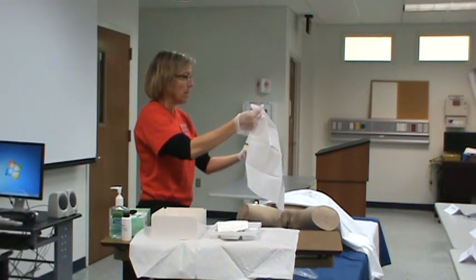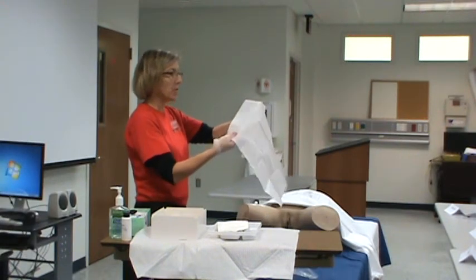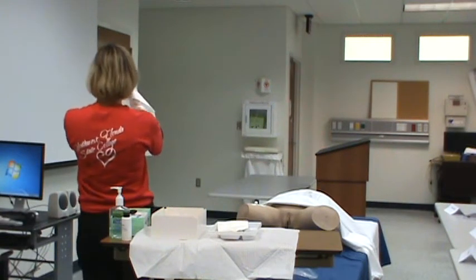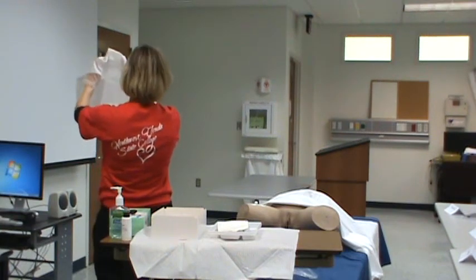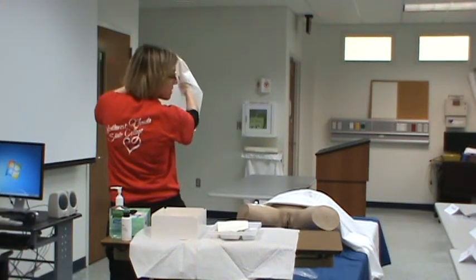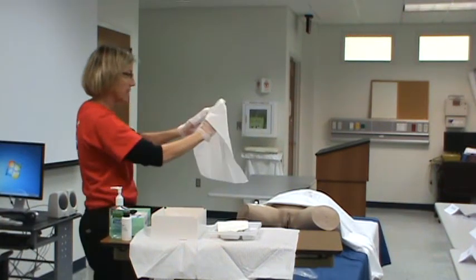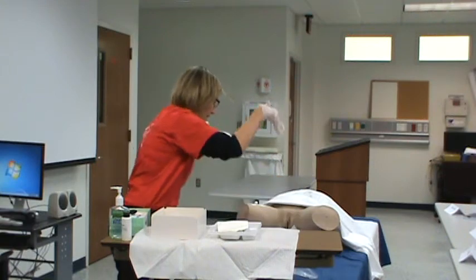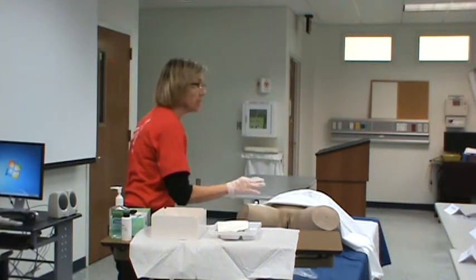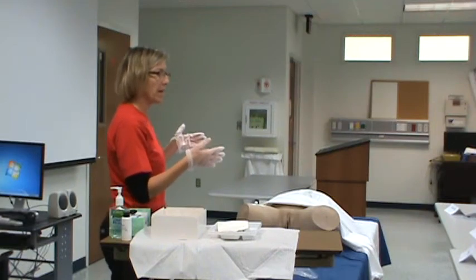Now, the underbutt drape is necessary to give yourself a field underneath the patient, but as you're placing it, you want to protect your sterile gloves as well. Students sometimes get hung up with this because you want to make sure you're not contaminating yourself when you're asking Miss Smith to lift up her bottom. So you're wrapping the underbutt drape like that. You're saying, Mrs. Smith, can you lift up for me? And you're doing it like that. Is it perfect? No. I could turn around and go sterile to sterile and rearrange it, but she's a bumpy bed and she normally has legs, and so I'll go with the way it goes.